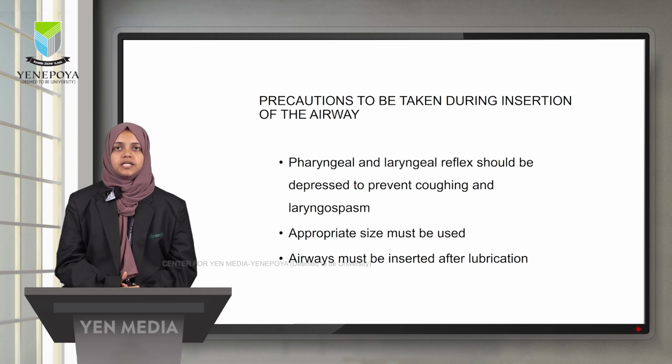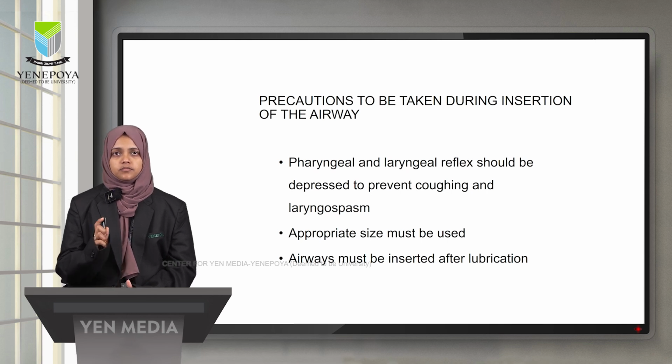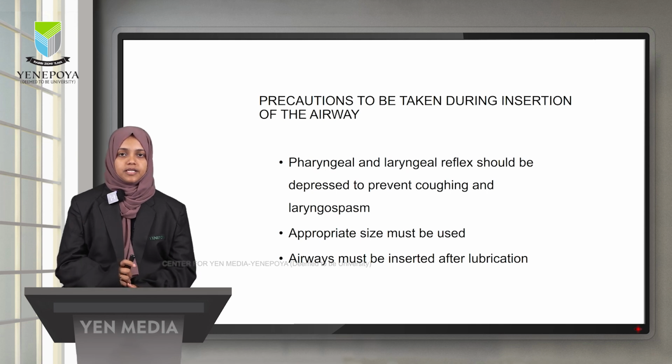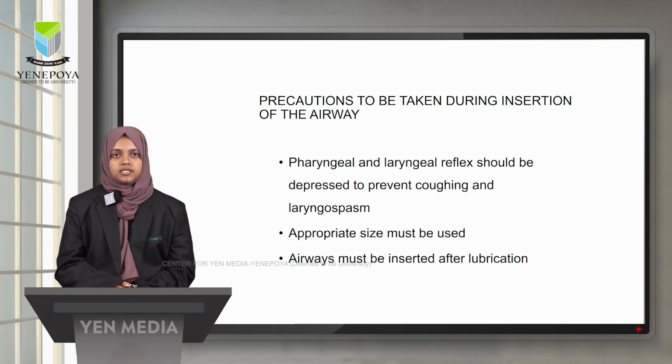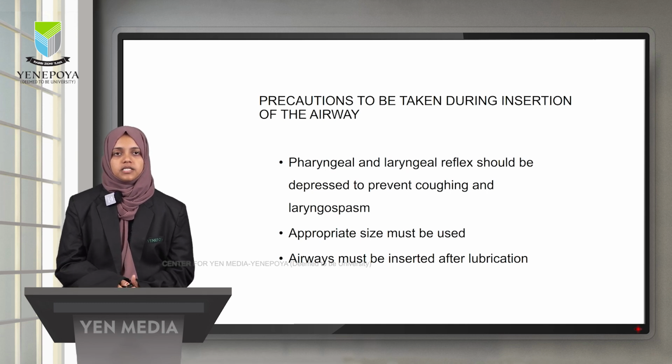Coming to the precautions to be taken during insertion of the airway, pharyngeal and laryngeal reflexes should be depressed to prevent coughing and laryngospasm. That means whenever an airway is inserted, the laryngeal and pharyngeal reflexes should be depressed by using drugs. Appropriate size must be used by measuring it on the patient. Airways must be inserted after lubricating with jelly.